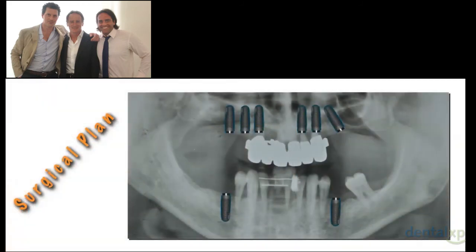And again, the surgical plan. We have the possibility to have the orthopantomogram, so we are using it, and we are doing our project first on the X-rays, then in the mouth. We're going to place on the right side of the patient 3 axial implants, and on the left side 1 tilted and 2 axial implants, and then we are going to put 2 implants in the posterior area of the mandible and extract all the other teeth.